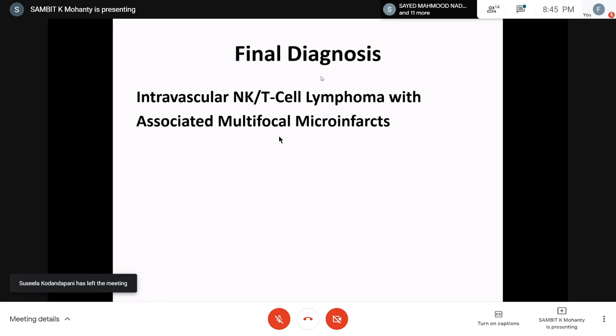So I feel in a core biopsy, when you do not have a defining marker and the morphology is not very classical, you basically have to have a consensus opinion in the department as well as with your clinical counterpart. Looking into LDH does help in that case, and how long the history is, what the other sites of involvement are, multiplicity of lymph node involvement, multifocal involvement. Those things really help in those scenarios. We usually get core biopsies. Excisions versus core biopsies, they're kind of half and half.